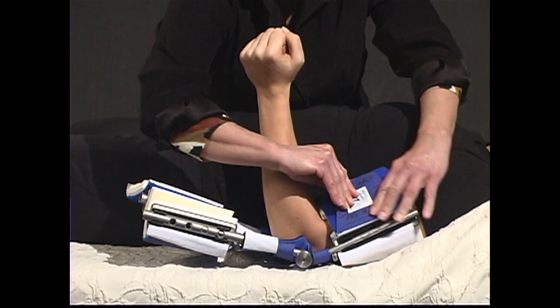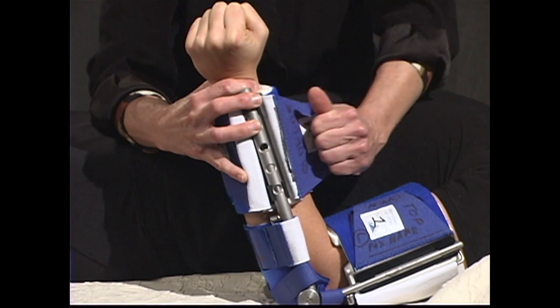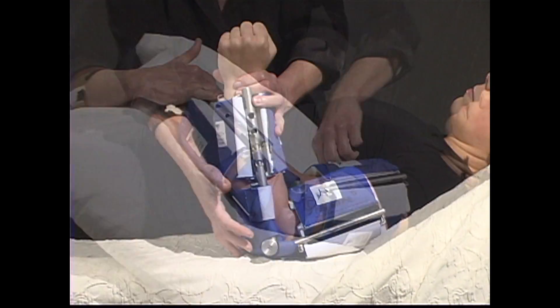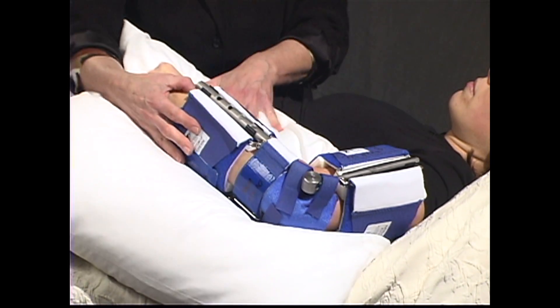Close the upper cuff. Bring the bottom of the splint up to meet the forearm and close the forearm strap. The strap should be drawn to the line marked by the sales consultant. Use a pillow to position the patient's arm in a gravity-eliminated position, slightly away from the body.